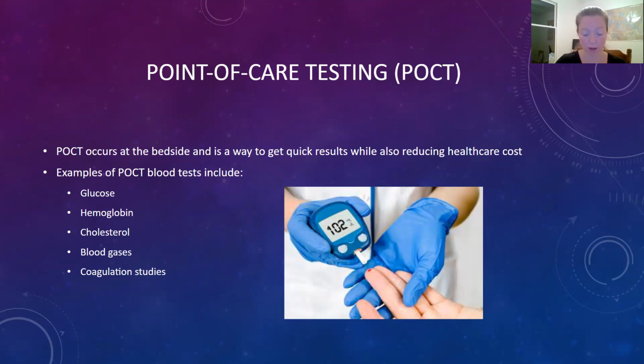On page 421, check your competency number 15-3 is going to give you the step-by-step guide for the glucose point of care testing. So make sure to review that along with the other point of care testing steps in chapter 15, just to get familiar with some of those, as those again might be something that you're starting to do as a phlebotomist, whether that be running the controls for a new test kit, making sure that the quality checks are done, the machines are calibrated appropriately, and that you're performing these procedures accurately to get the best results.